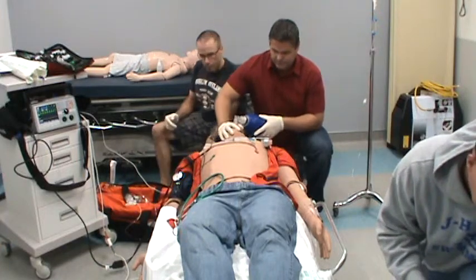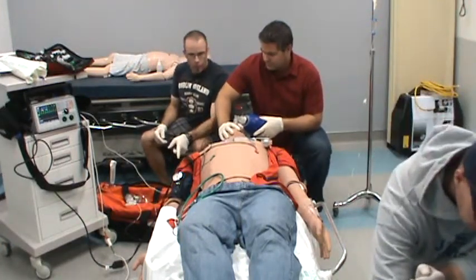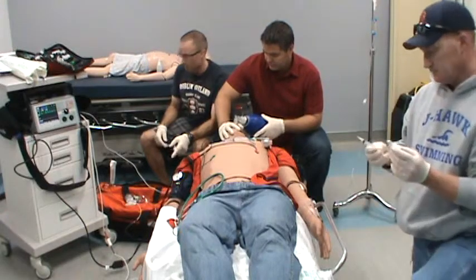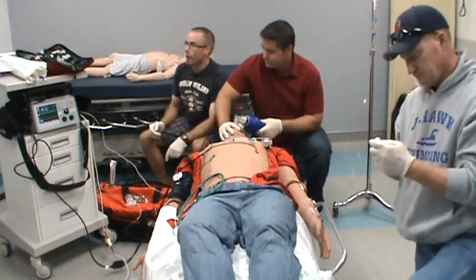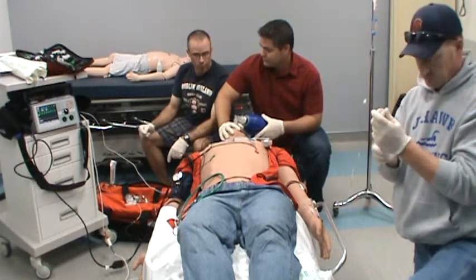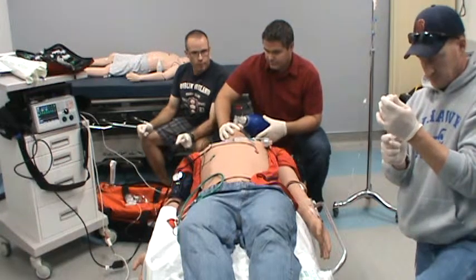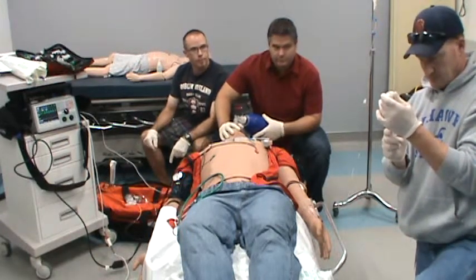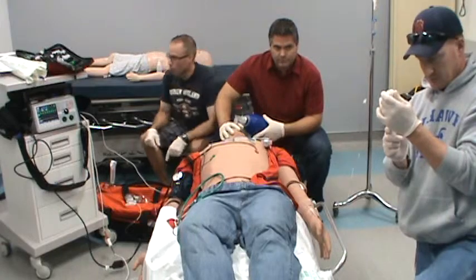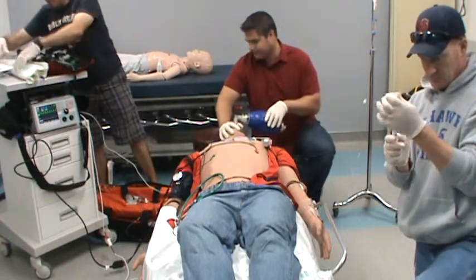Alright, I'm going to finish setting up all my airway stuff. Let's see, we have our C-collar out for once we get the tube in. And I have my primary airway, my combi tube, and also my crike kit just in case. We have all our basics going. Rob, how are we doing with the meds? I'll be done in about 2 minutes. Okay. We're hooked up to O2 here too, as well.